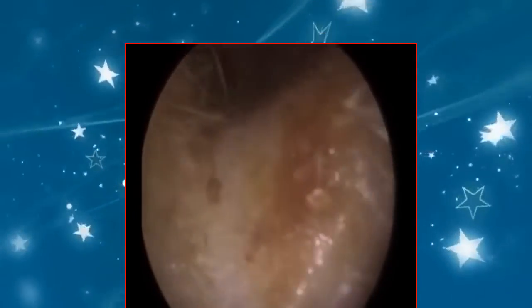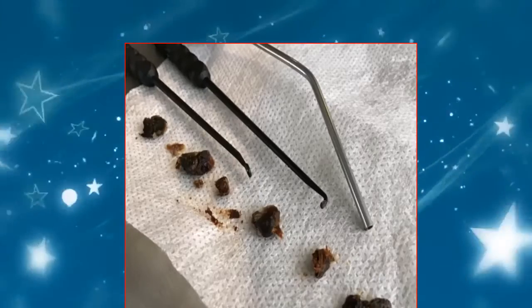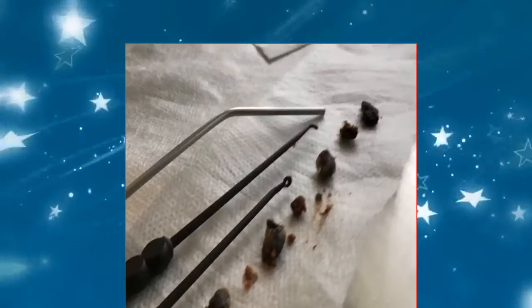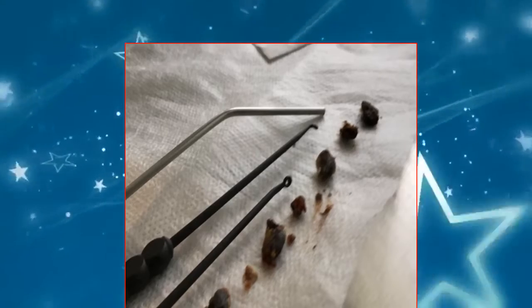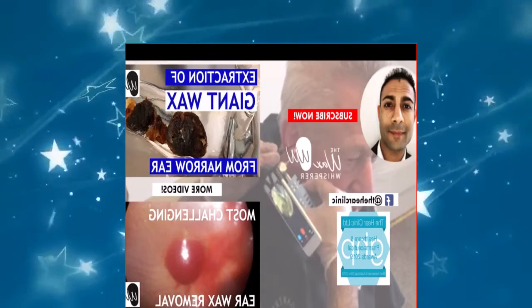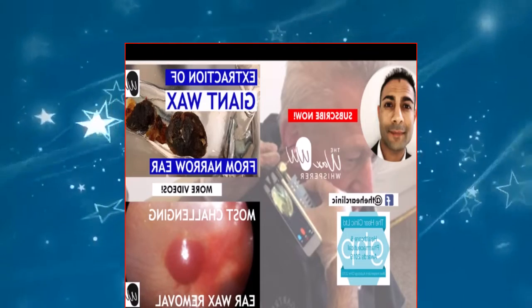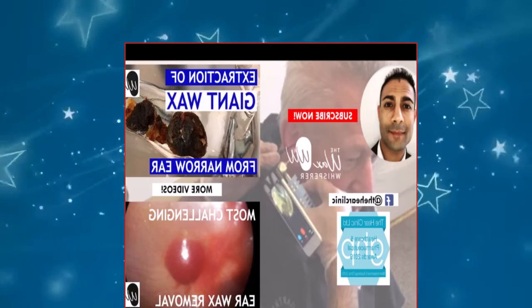The patient was very nervous, and I didn't want to really add to any anxiety that he had prior to having the procedure done. So we're going to leave that. It's not going to cause him any symptoms. Sometimes less is more. We don't want to remove wax for our own ego and try to remove every little speck of wax, because that can have adverse effects for the patient. He may then find that uncomfortable and he may not return. Our duty as an earwax removal specialist, a clinical ear care specialist, is to relieve the patient from their symptoms, which we achieved in this case.